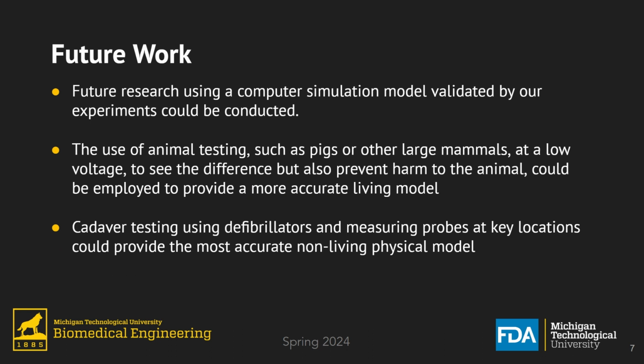Some future work we hope can be put into this subject. Using a computer simulation model validated by our experiments could be conducted. This would allow researchers to have insight into the electrical attenuation of the human body without actually having to use the human body, as they are difficult to source, and there are a lot of legal issues, not to mention ethical issues with doing so.